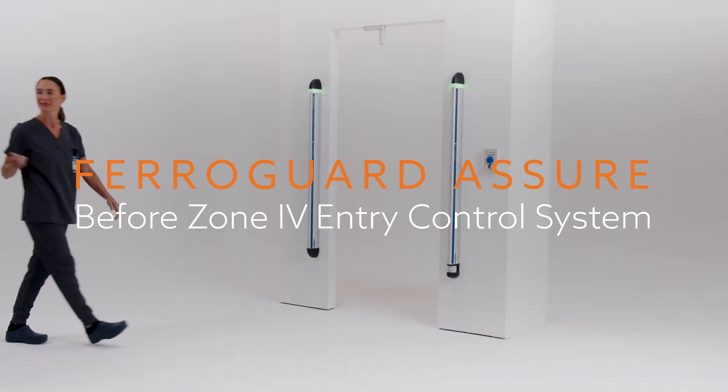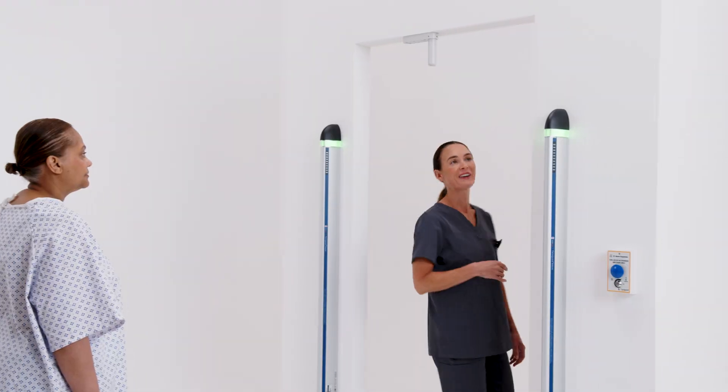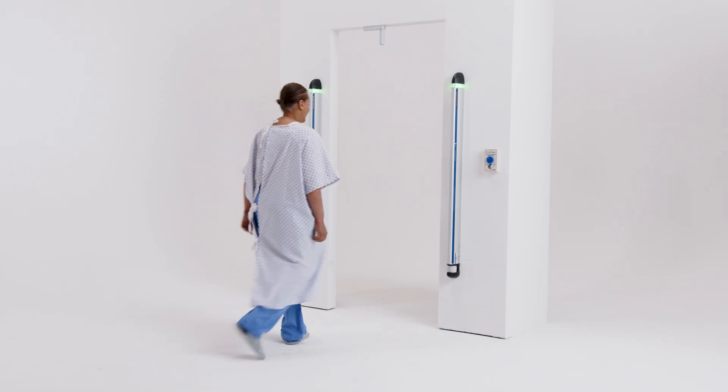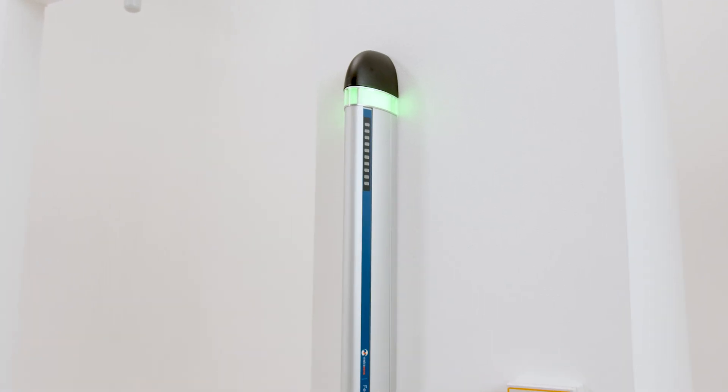As you approach Zone 4, FerroGuard Assure stands guard. This state-of-the-art Zone 4 entry control system is designed to prevent any ferrous objects from entering the magnet room, safeguarding both patients and staff.